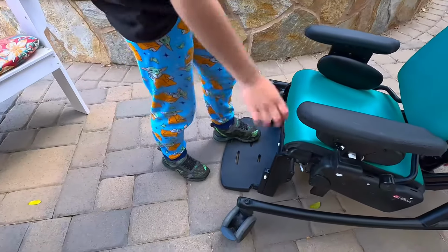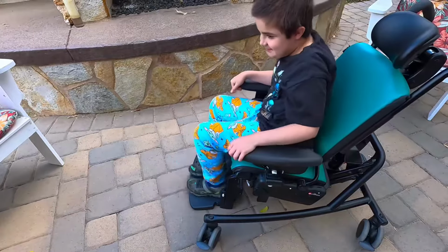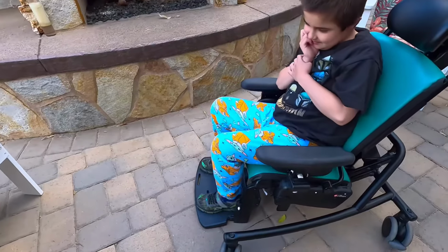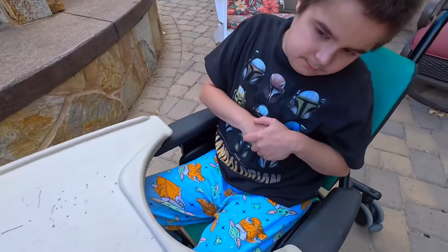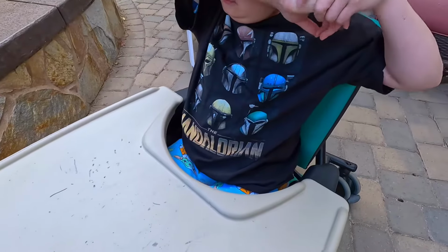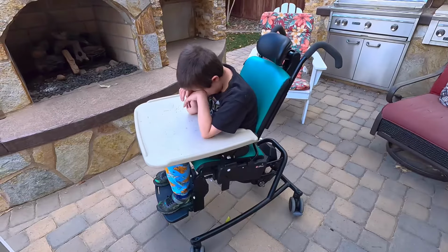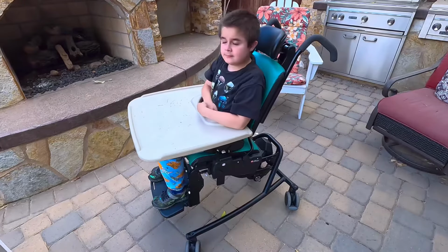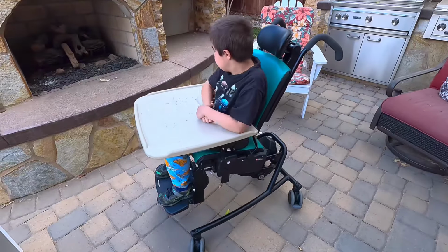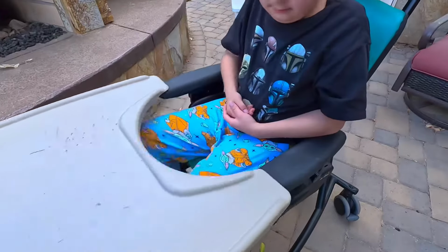And the foot plate should always be down, and in that position Billy can get into the chair, and then you would secure the tray, assuming that he needs it, which is in most cases. For exiting the chair is very similar. Of course, you want to first make sure that you lock the casters, which I have already done, and then you'll want to take off the tray.